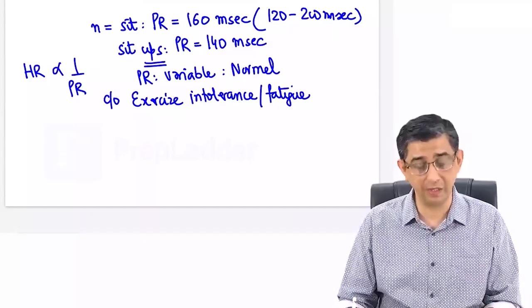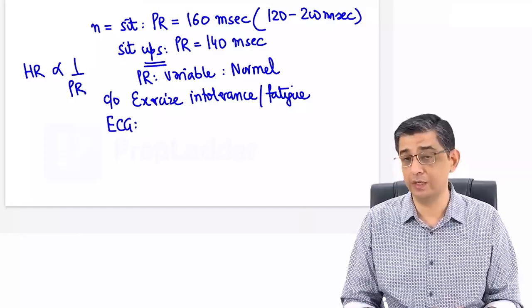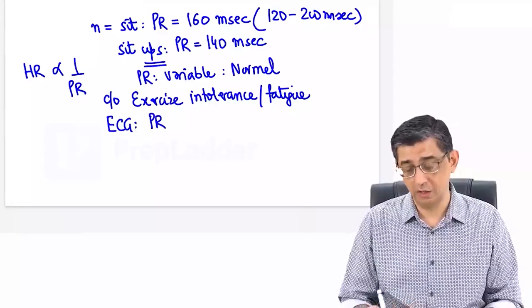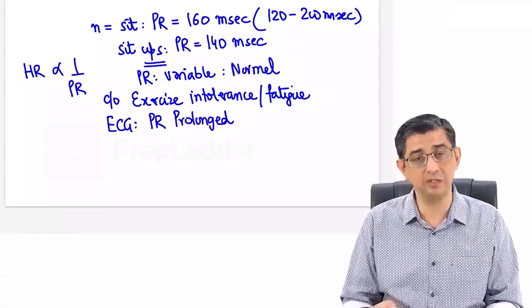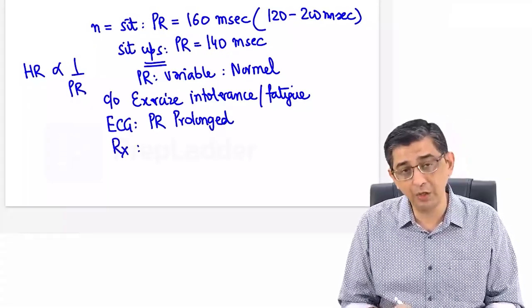So you might even miss the diagnosis, but subsequently, because the complaints are persistent, you decide to get an ECG done. In this person, you will always notice that the PR interval is in excess of normal. It will always be more than 200 milliseconds and will not change with exercise. That's the point. It will not vary with exercise like it can in you and me.